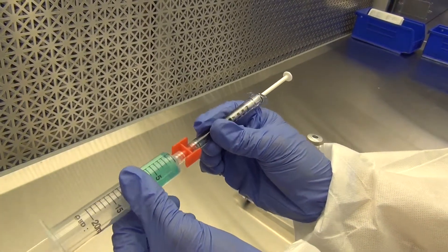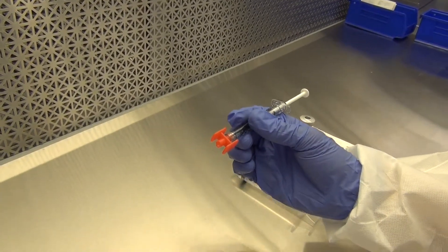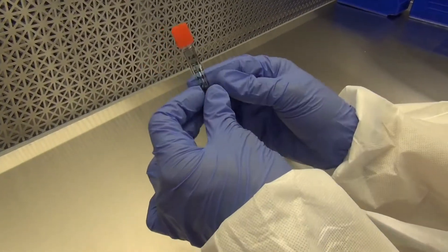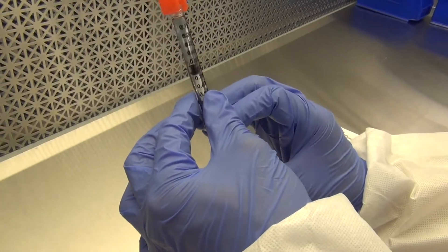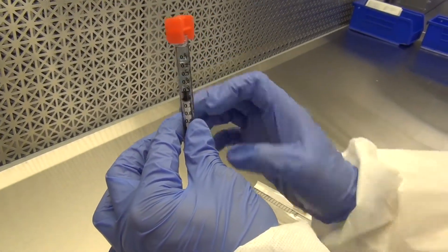Remove the 20 milliliter syringe. Go ahead and try and tap out the air bubbles.